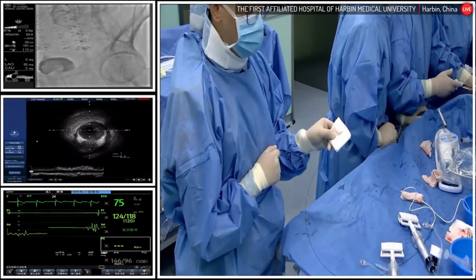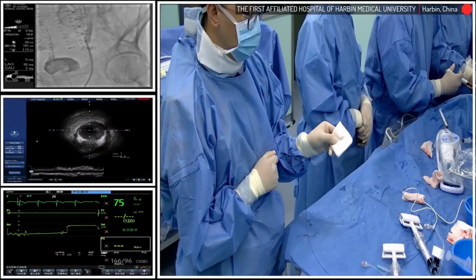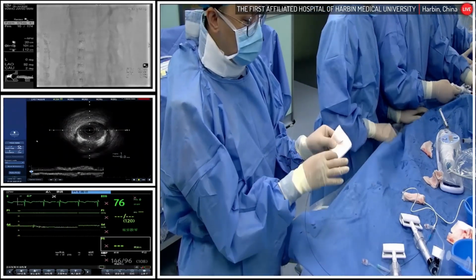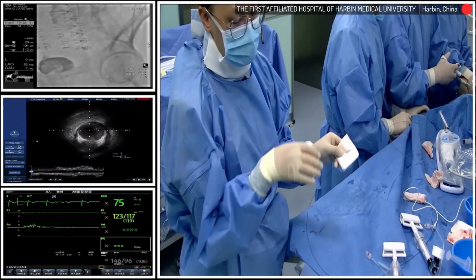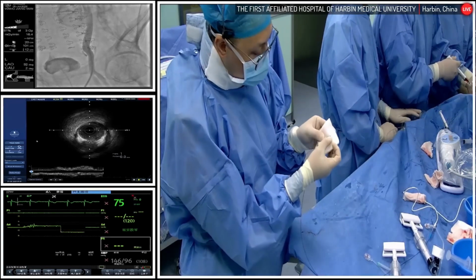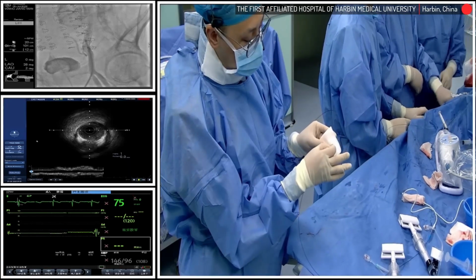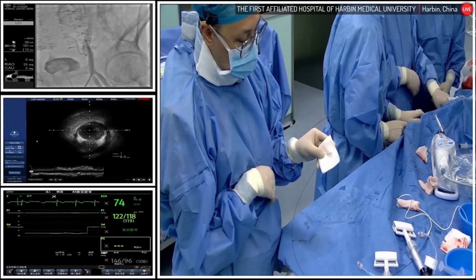And I noticed that there is a similar device in the US, produced by the Assist company. However, I need to emphasize that this device is superior in the diameter and size of the catheter to the other microcatheter-based FFR products currently on the market. And you may notice on the tip of this microcatheter there is a pressure sensitive device to measure the pressure of the distal coronary artery and compare it to the aortic pressure.